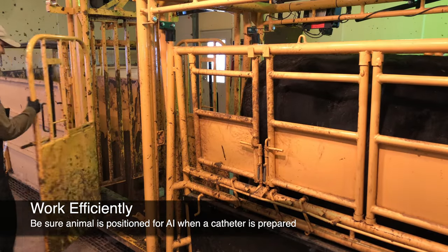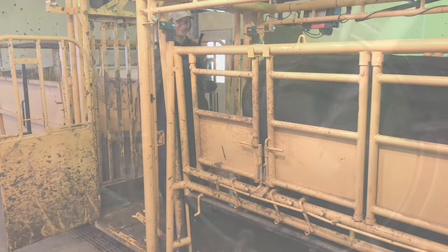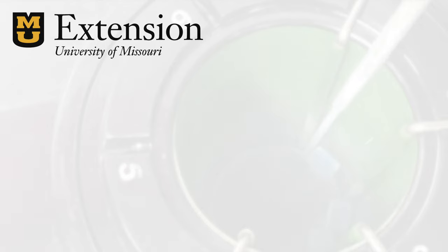Remember, we recommend semen be deposited within 10 minutes of thawing, so be sure the animal is already positioned for AI and work efficiently when a loaded catheter is prepared.